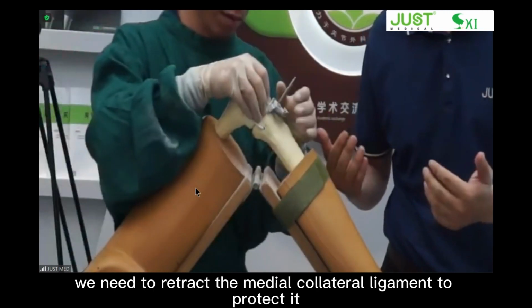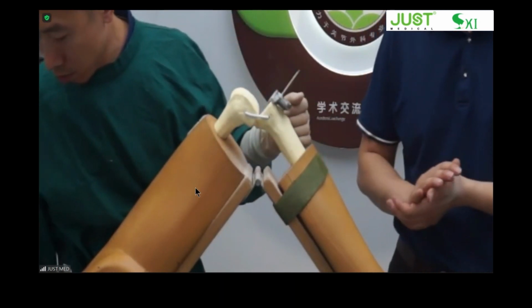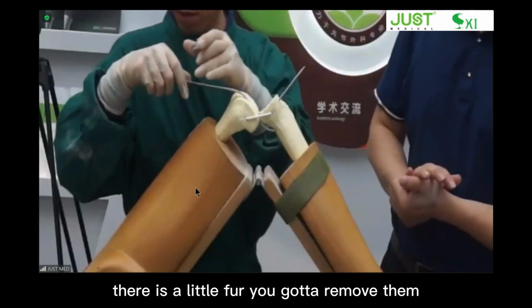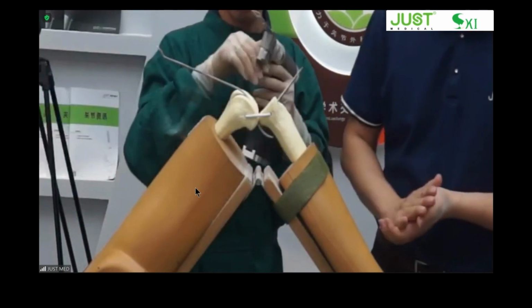Before making the cut, we need to retract the medial collateral ligament to protect it. Then we cut across the tibia. Yeah. If you find there is a little burr, you got to remove it, either file or recut, to make sure you got a smooth surface.